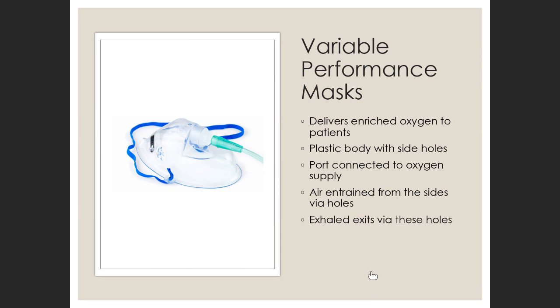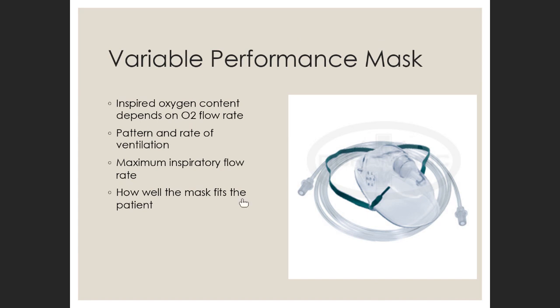Don't get caught. Those are ways in which you can get tricked in an MCQ. You gotta be precise in how you think. All right? Gotta be precise in how you think. So from these masks you get oxygen-enriched air, and you get about 0.4 or 0.5. Usually not more than that, with 4 to 6 liters. Okay.